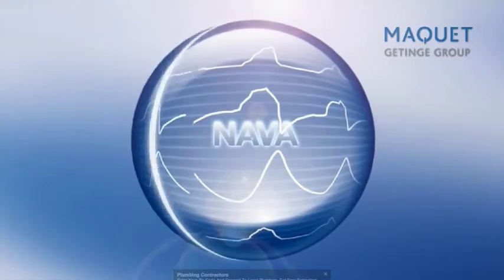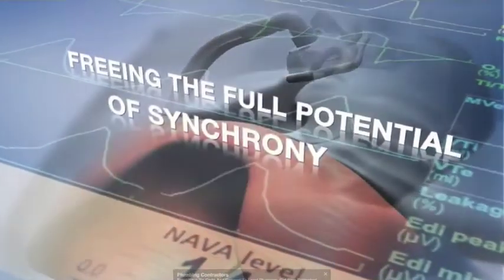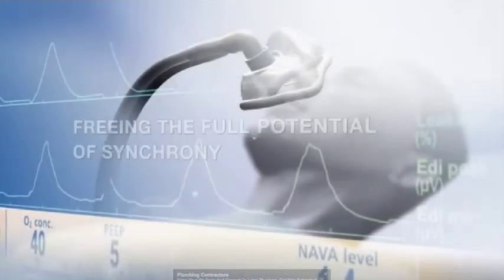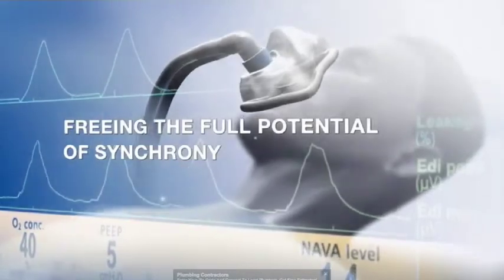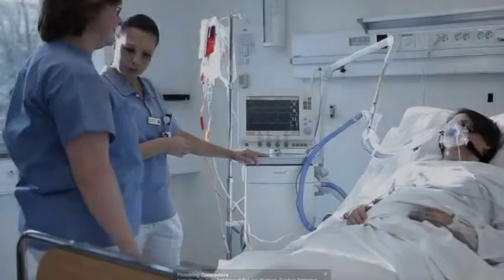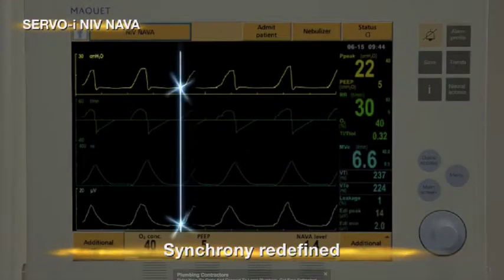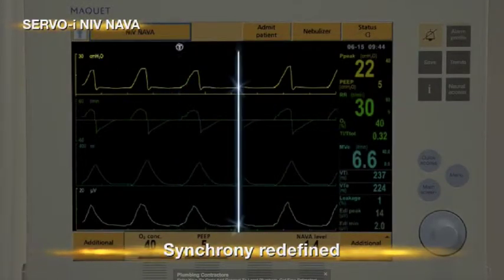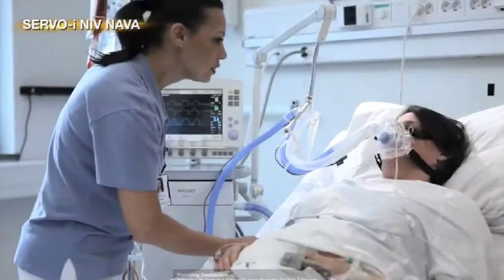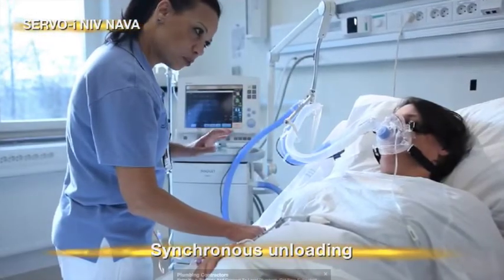As I said, it can only be used on the Servo-i ventilator, but it can provide both non-invasive and invasive ventilation. So in the non-invasive part, it's the same, synchrony redefined. But we have to think about that: when we put a tube into the nose, it's also an invasive procedure.